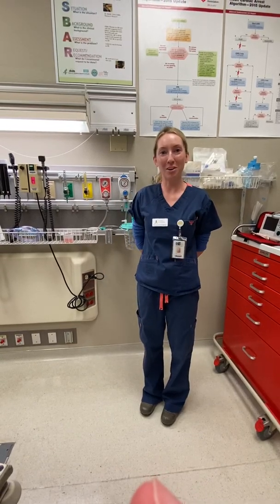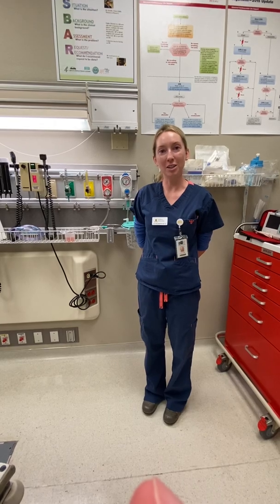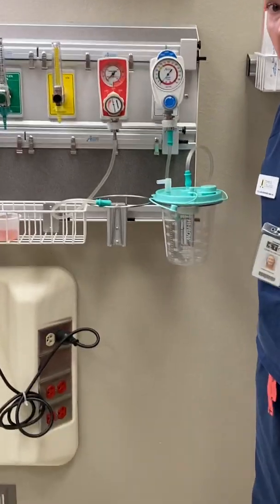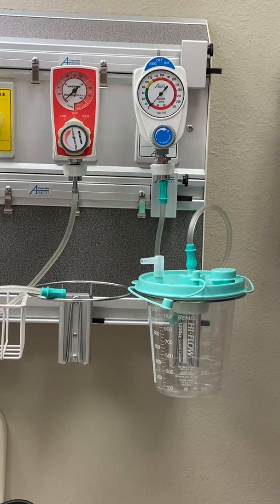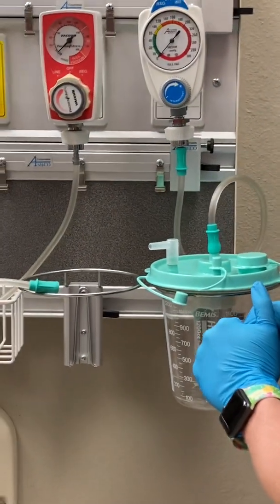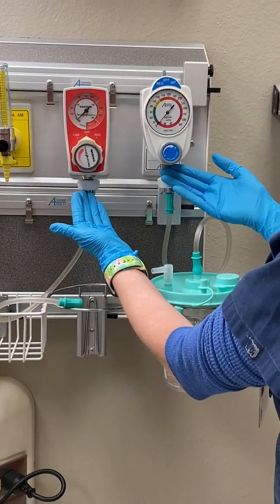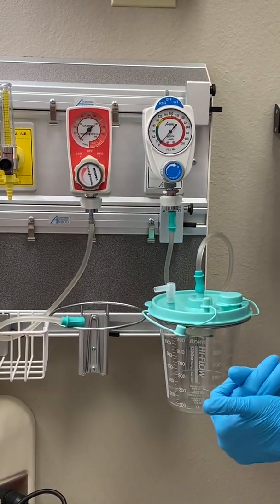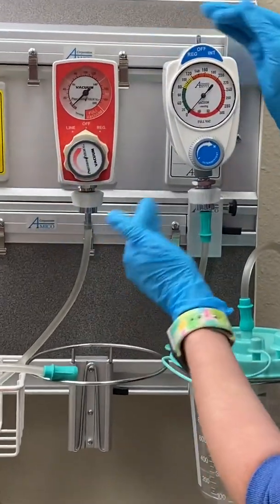Hey guys, Ms. Sherard here. Just wanted to do a real quick tutorial on suction regulators. You may see these in the clinical setting, at the Sim Lab, the NEC, or the HSC. I wanted to give you guys a brief overview of how to use them and what they may look like. Here are two examples of suction regulators — they're both suction regulators, just from different brands. I'm going to quickly go over what some of these mean and how to use them.